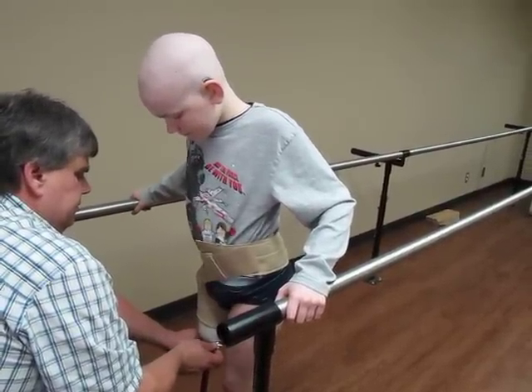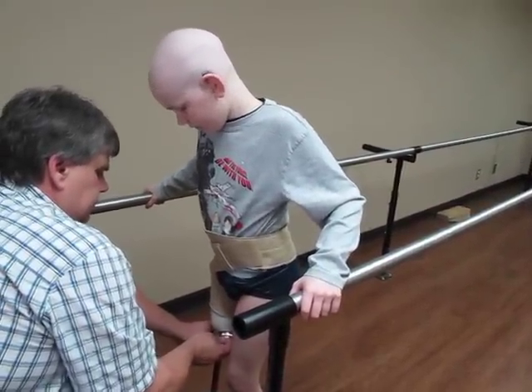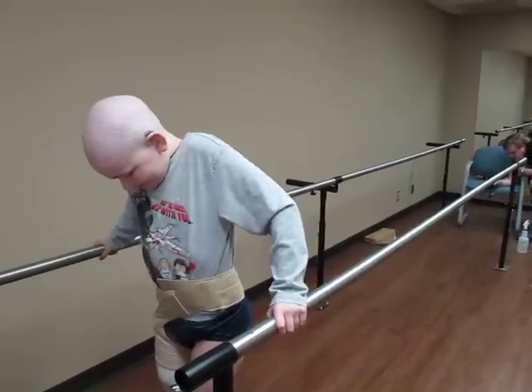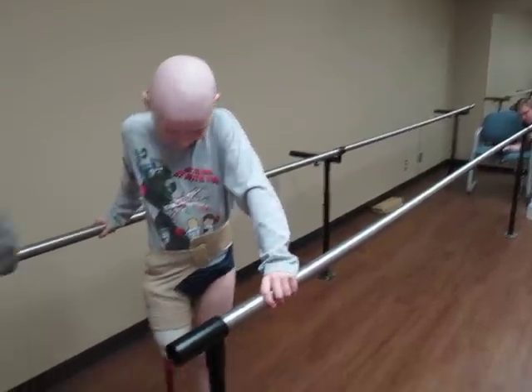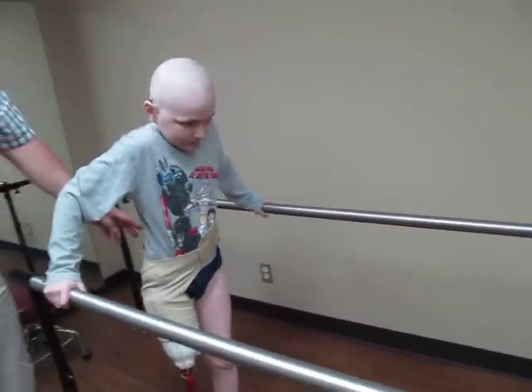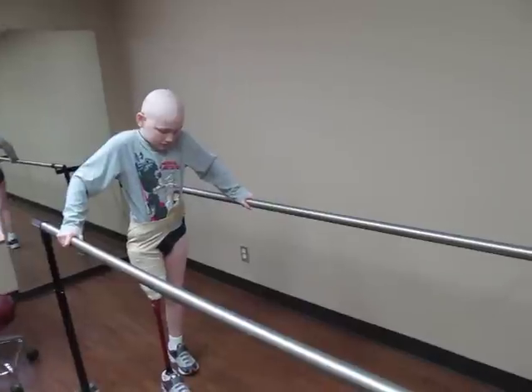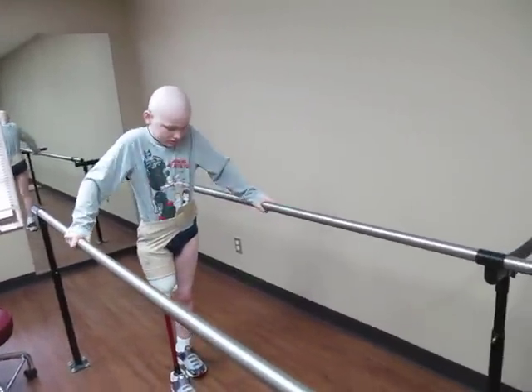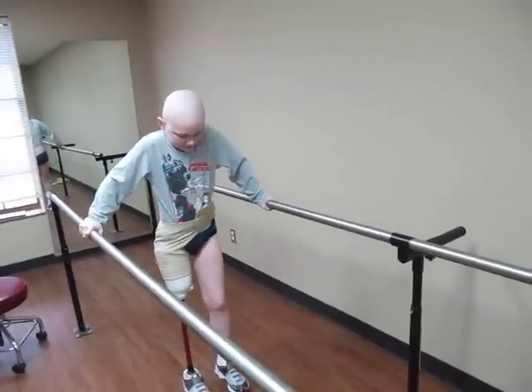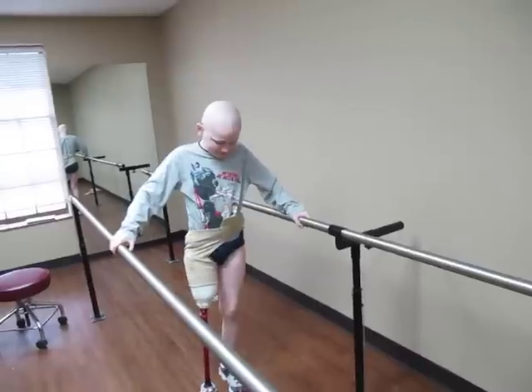Pull your weight down for me. Okay, back up, back down. Can you turn around if you want? Okay. Just take baby steps. Kind of take up your feet. Try not to twist. Do what you want to twist. You're doing awesome, buddy. Look at that smile. We didn't see any smiles yesterday.